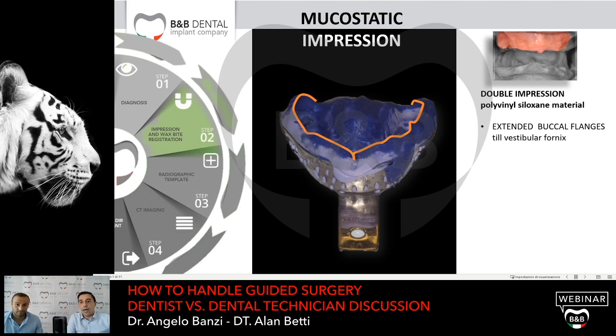So the impression has to have the extension shown in these pictures. We have to arrive at the base of the fornix, and for the total upper edentulism, until the tuber. This is really important.